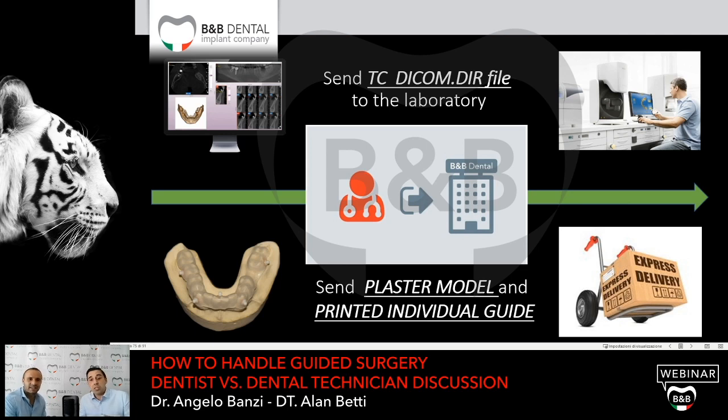It's very simple and easy to check in the mouth of the patient. You have to use rigid plastic. 1.5 millimeters is enough to make this radiological template, and you put the marker as we already saw for the totally edentulous case.